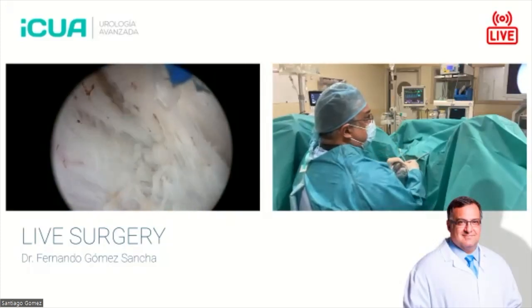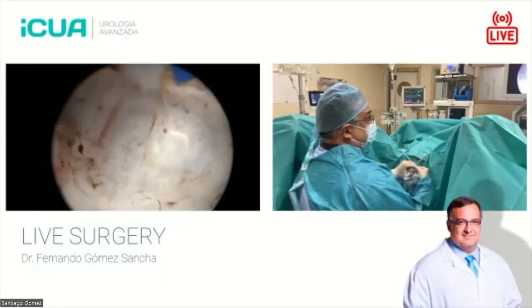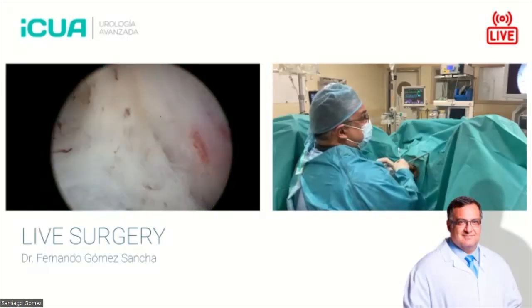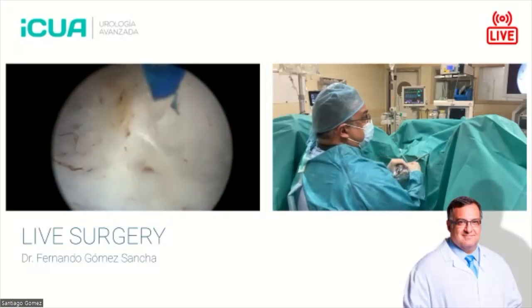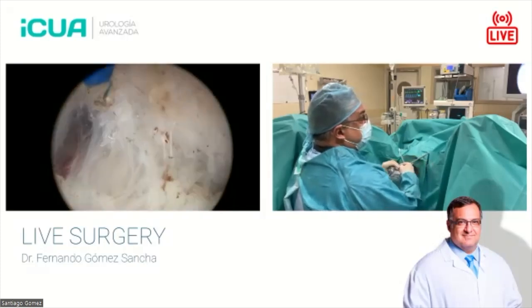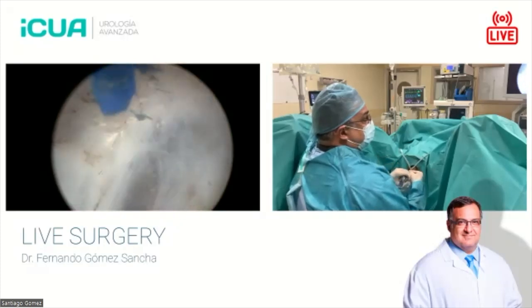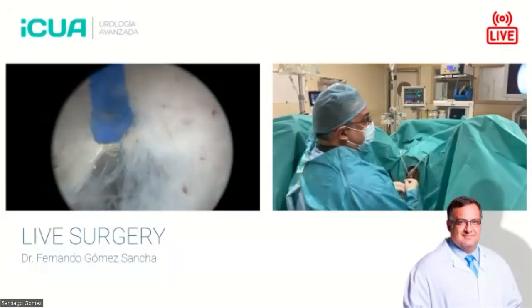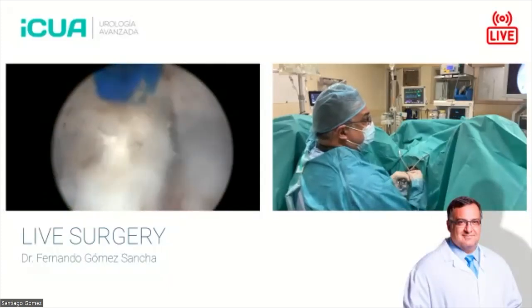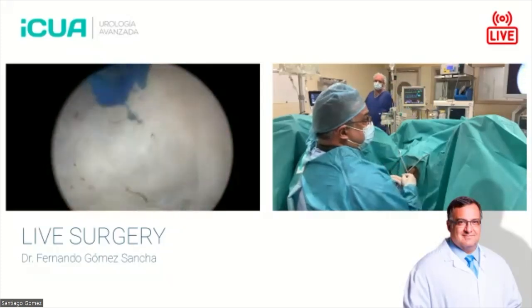You see, I'm trying to make a very efficient use of energy. If I am a very good surgeon, I can choose the right distance to the tissue, I have a nice effect that gives me good coagulation, and I'm a fast surgeon. But a slow surgeon could take a long time in the same spot to get good hemostasis, to coagulate. So two different surgeons could use hugely different amounts of energy.